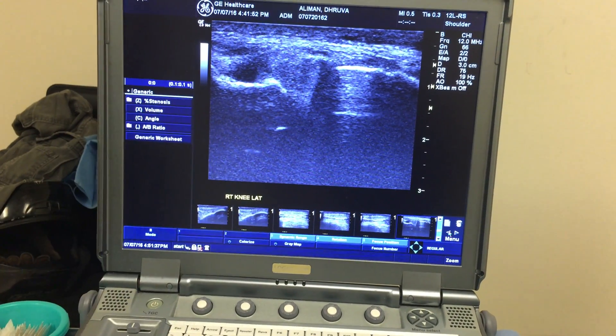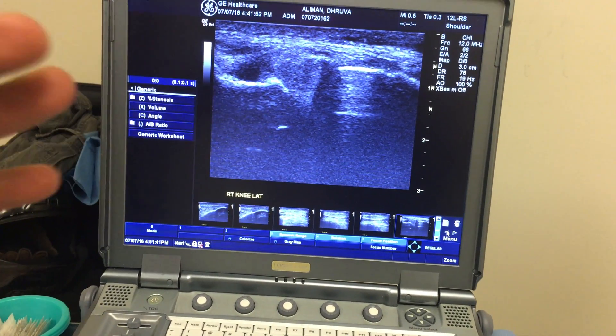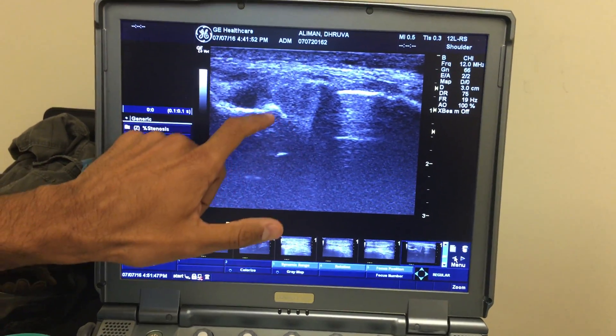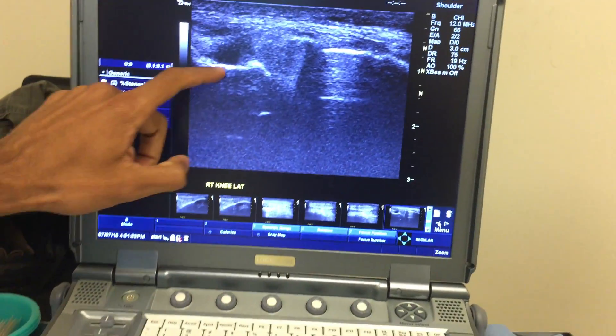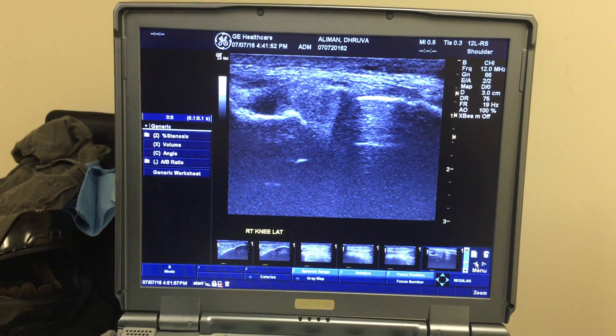There's a little bit of this on the lateral side. Your medial is affected too, but to a milder degree. Is that the bump that I'm seeing? Yeah — this is the bump around the meniscus. The bump you have up higher — this is north, this is south.